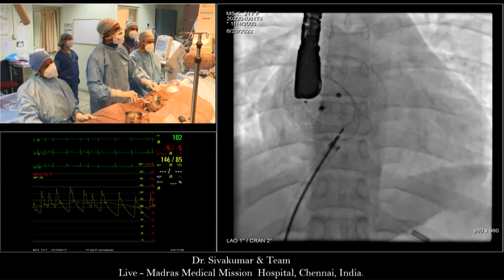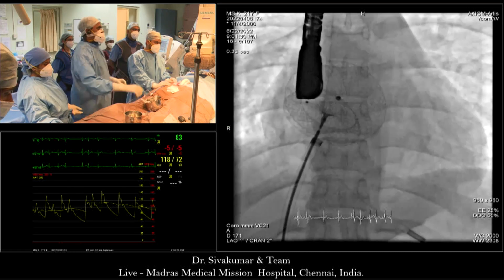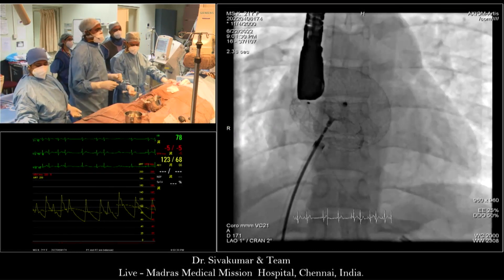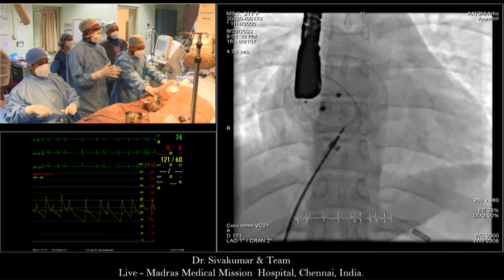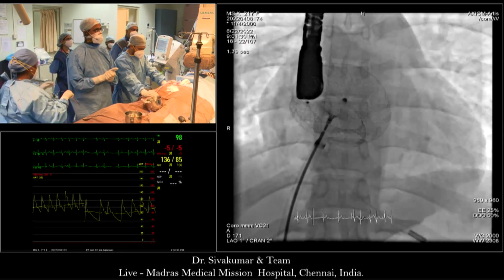Leave it, release it. That's fine. You want to release it? We're going to release it. Srija, now show the transthoracic view. Shiva, final very quick echo pictures.